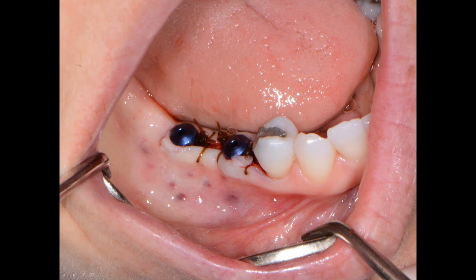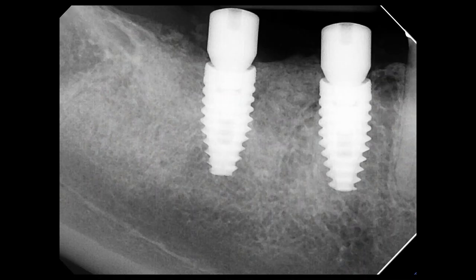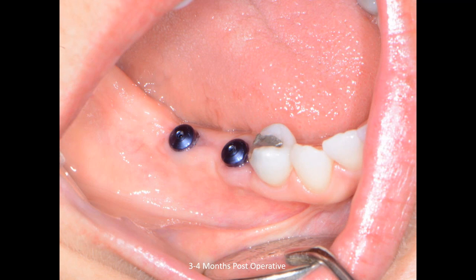Because of this flap being cut more towards the lingual portion of this ridge, now we'll have keratinized tissue on either side of these implants. So tissue punch was not ideal in this particular case. Here we see the implants placed with the healing caps.